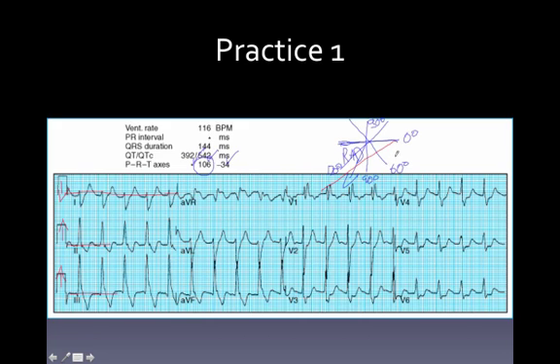Lead 2's perspective, and these are positive electrodes, these three known locations, says that I'm headed towards it, so we're probably popping out right at about 91 degrees or something like that, 92. The machine says 106. Let's check our third one here. Our third one says it is popping out here too at about 106. So somewhere around here is where that beat is headed towards, off of 3 known locations. This is kind of like triangulating.